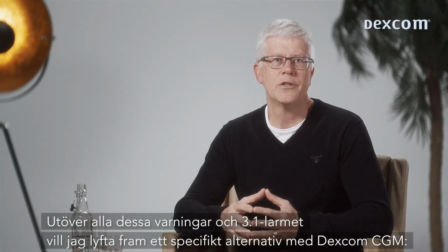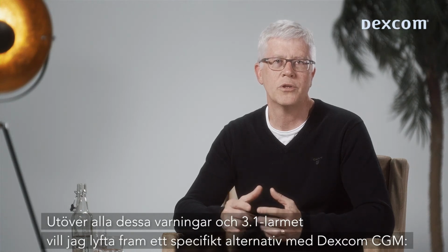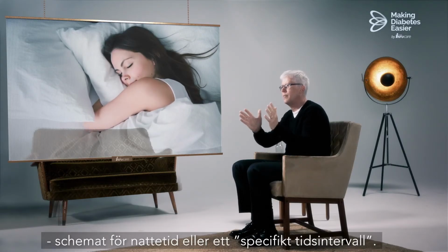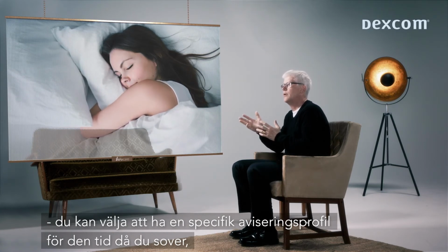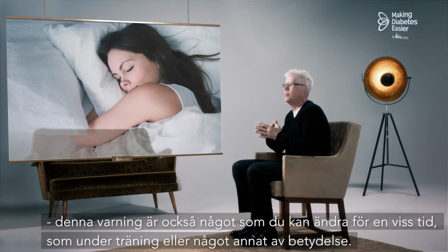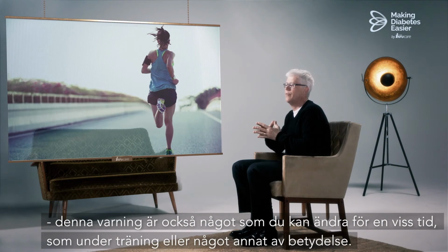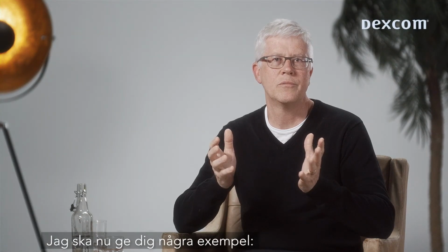Beside all these alerts and the 3.1 alarm, I would like to highlight a specific option with the Dexcom CGM. The night time or specific time interval schedule. You can actually choose to have a specific alert profile for the time when you are asleep. And the alert is also something you can change for a particular time, like exercise or anything else of importance. I would like to give you some examples.